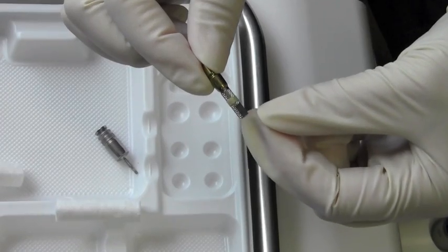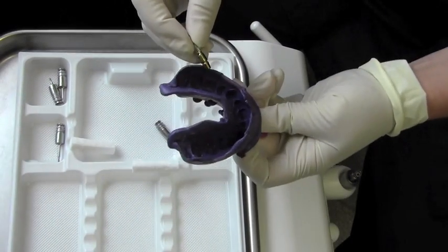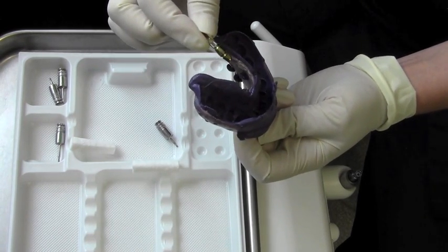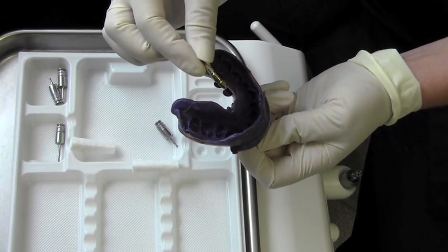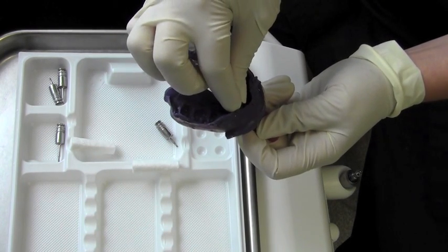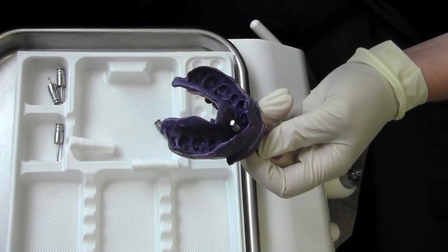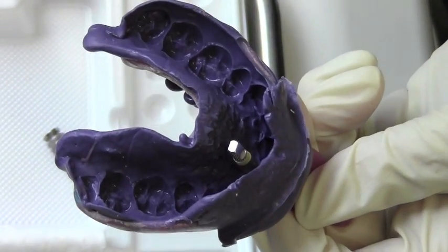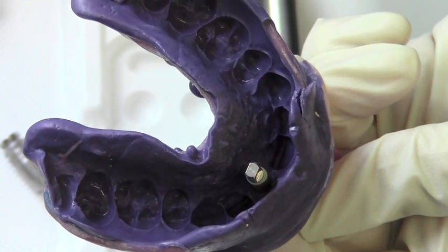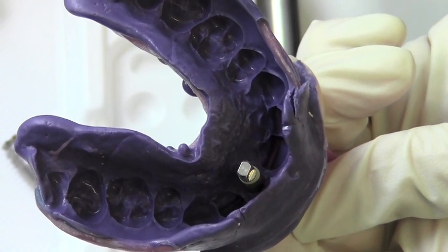Lisa's going to pick up the impression and locate the flat surfaces of the impression post to align up with the flat surfaces of the transfer cap in the impression and seat that firmly down. There you have it — the impression with the impression post and milling analogue attached, ready to go to the laboratory.